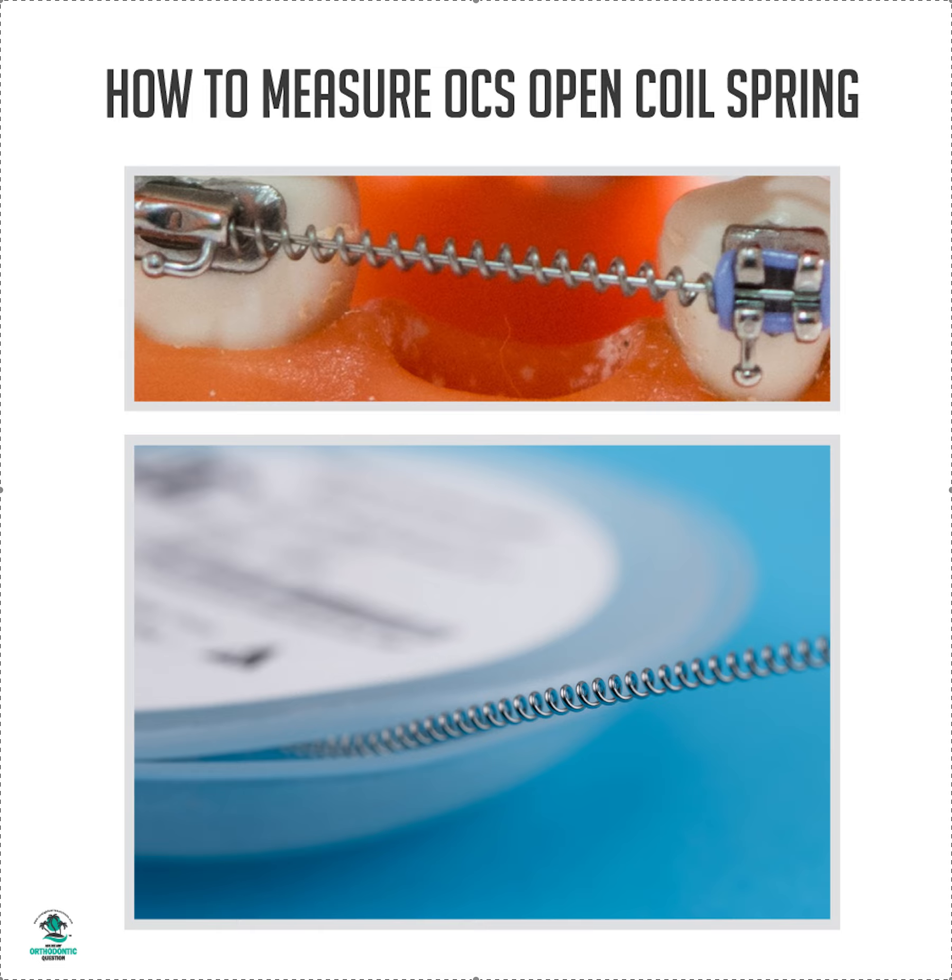Amanda with Straight Smile Solutions, straightsmilesolutions.com. Let's talk about measuring your unit of open coil spring. A friendly reminder: your open coil spring needs to be used only on wires that fill the slot. Most of you are probably using 022 slot, so let's talk about 022 slot.